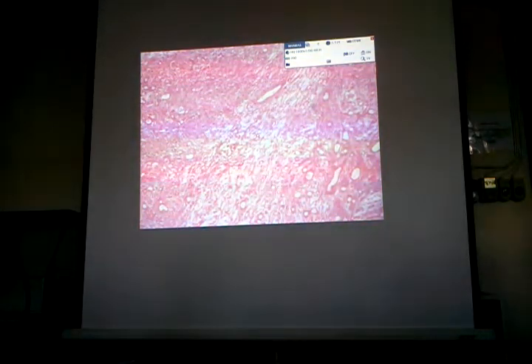And then that is the characteristic connective tissue that is usually present in this tumor of the parotid gland. So that is the histologic appearance of a myxoid stroma. Myxoid stroma is almost similar to a fibrous connective tissue or a dense irregular fibrous connective tissue.